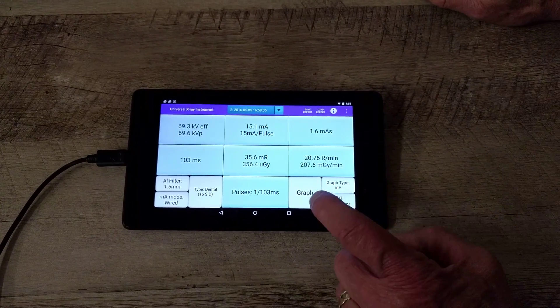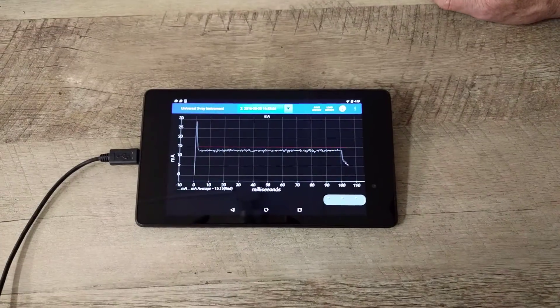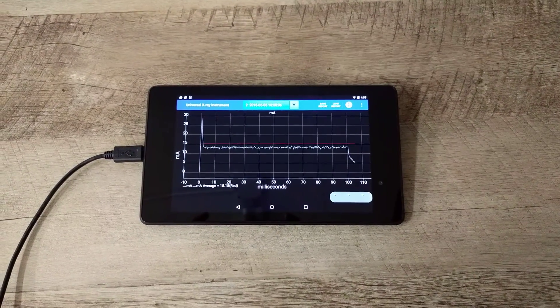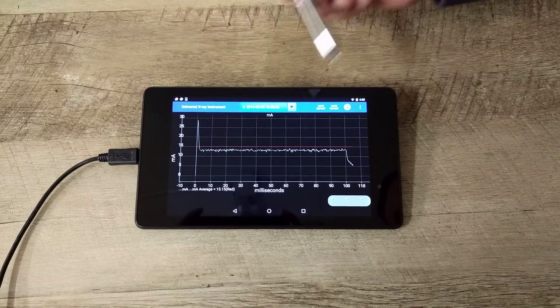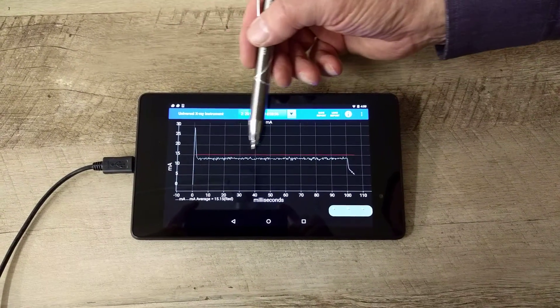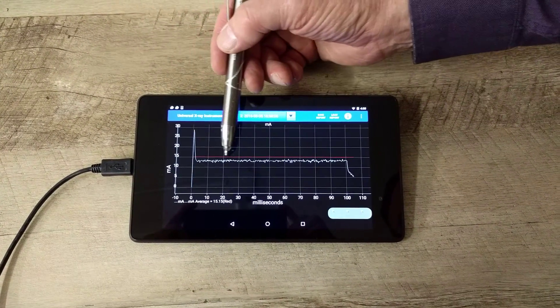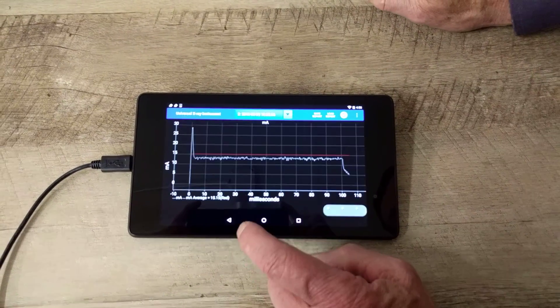And here's what the graph of the MA looks like. You can see some overshoot here, that's not unusual for this type of X-ray, and then it levels out and falls.